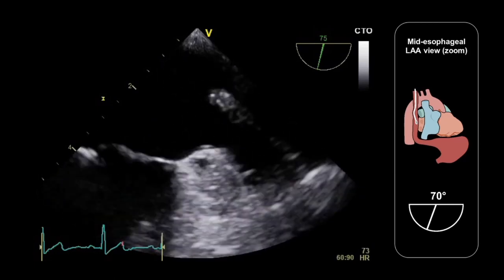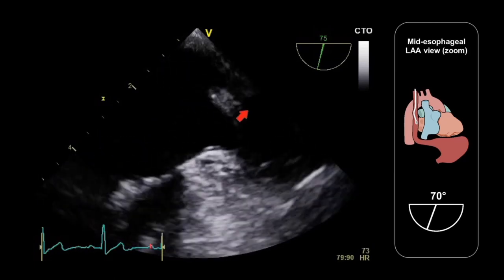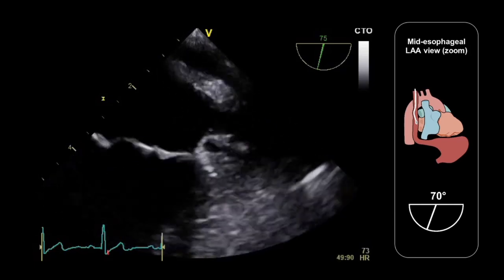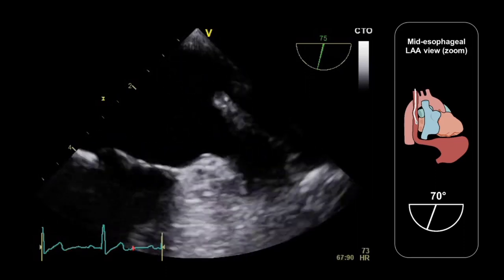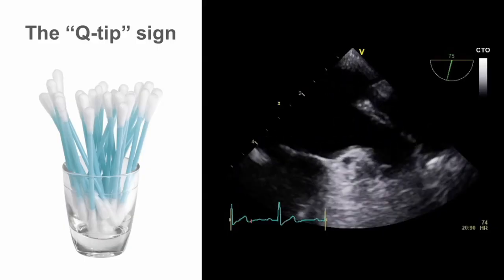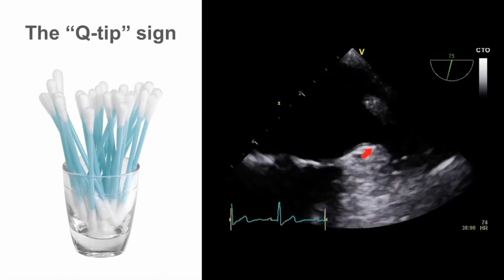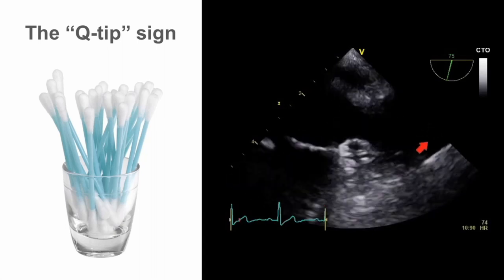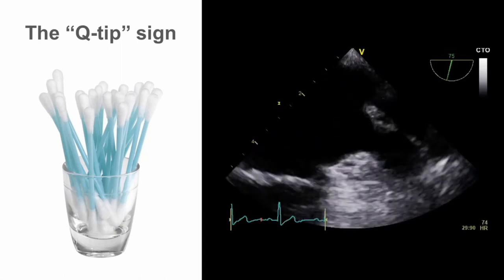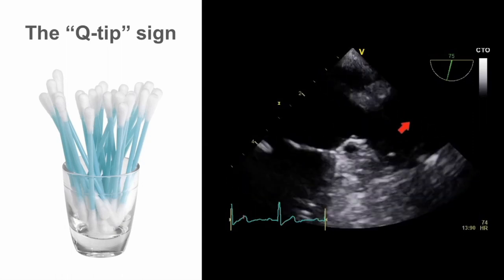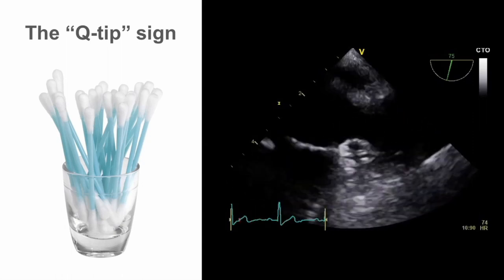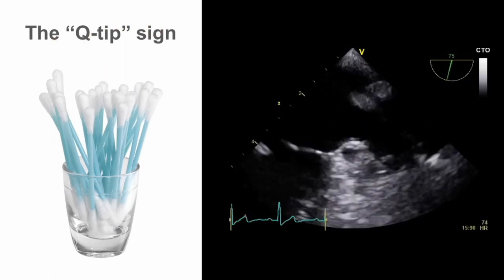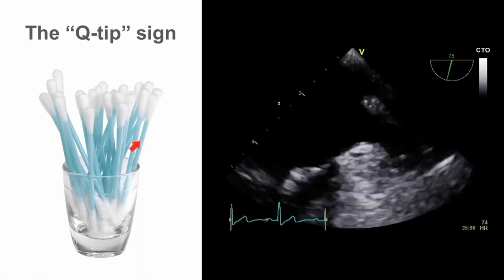We can adjust the depth of the imaging sector to really maximize the size of the left atrial appendage on screen to ensure thorough inspection. When we really zoom in, we can appreciate not just the anatomy of the appendage but also the postero-lateral ridge, and we can see that the ridge itself has a rather bulbous end — this has given it the common nickname of the Q-tip sign, because the postero-lateral ridge looks a little like the end of a Q-tip.